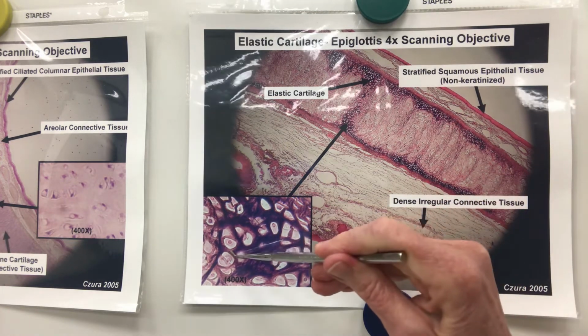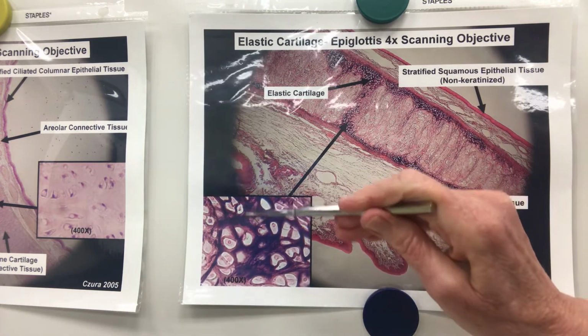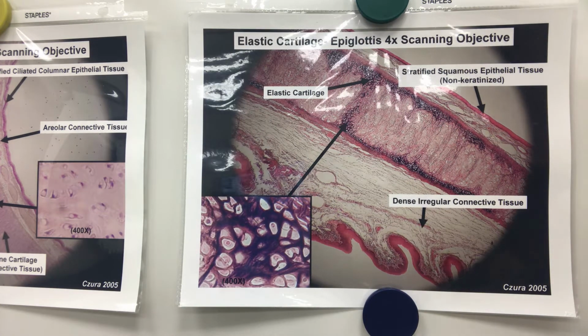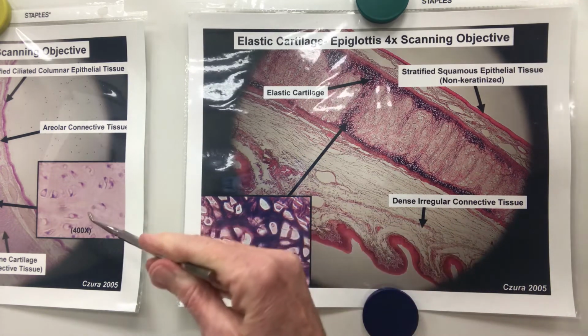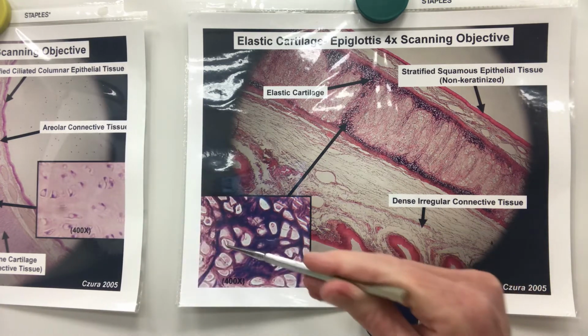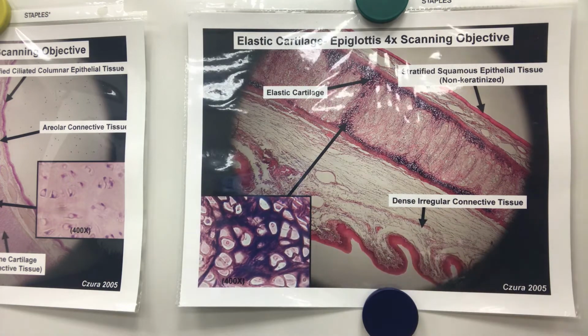So here we have the cartilage. Again, the cells are in their own little houses. But we now have in between it some very dark elastic fibers that have the ability to expand and then spring back. So that will give away the elastic cartilage. Looking at the cells, you can see over here the cells of the hyaline cartilage with the smooth matrix, the cells of the elastic cartilage with the dark black elastic fibers.